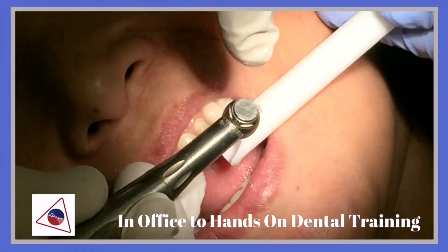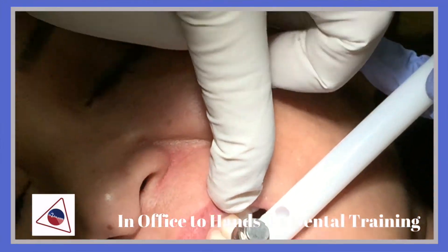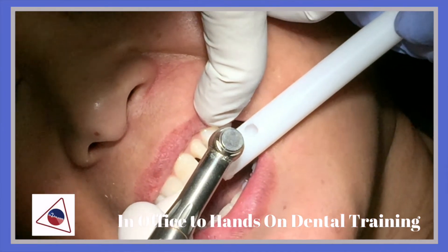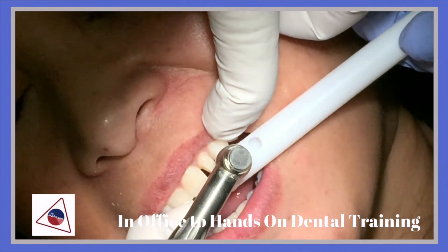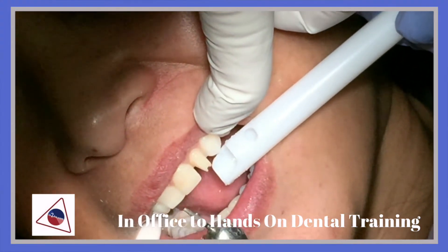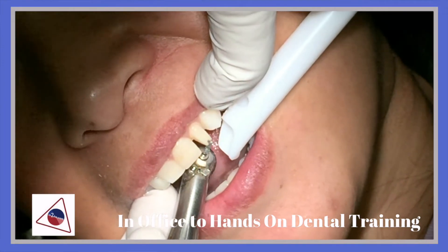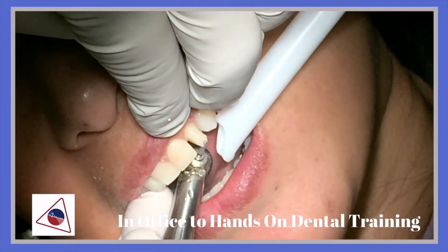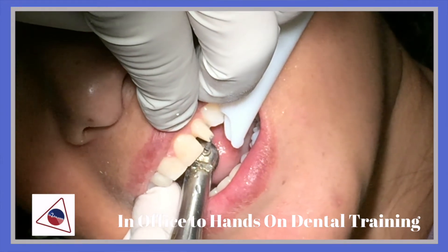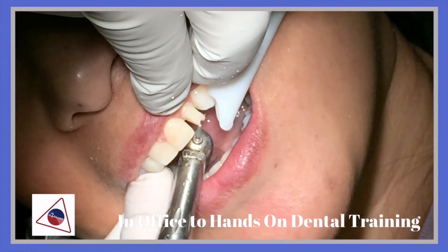Now I'm going to do the incisal edges of tooth number 10. If you look at that, I've got the diameter of the burr that I'm using. That would be about a millimeter incisal reduction.